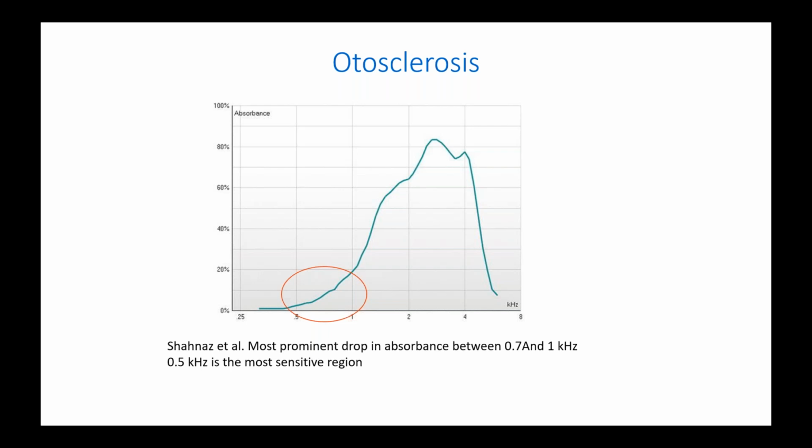My only worry is that in the future, people will wait for the instrument to tell them, okay, this is otosclerosis, this is this, this is that. They won't bother to look at the graph. I think the way you do it requires more thought to decide. You don't have a standard A-type tympanogram for otosclerosis. You really have to look into the graph and say whether stiffness is affected, whether mass is affected, and then correlate it with the pathology. So I think it gives more food for thought. No, it will give more food, but then they will simplify it. I'm just seeing the future. That's what they do sometimes.